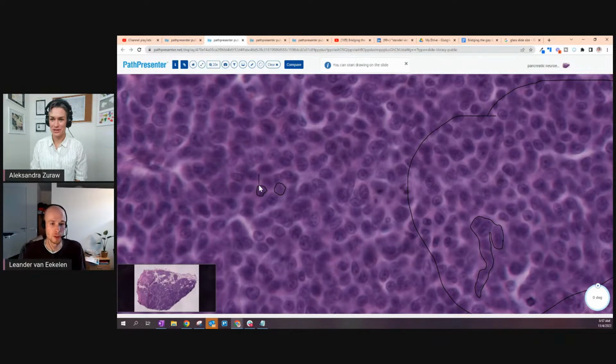And I just showed inconsistent data. If you see that there is like lighter cytoplasmic, I should be more detailed than that. So I already did a sloppy job here. Yeah, and there's been research done on how big the effect of inconsistency is. You let one reader do one cell, and then you let another reader do the same cell again. You train on both sets, and then you can see actual measurable variability between model performances based on who is drawing the circles. So that's a nice insight. It shows that the quality of segmenting cells actually really does matter.